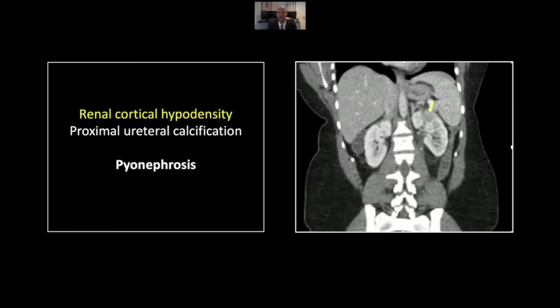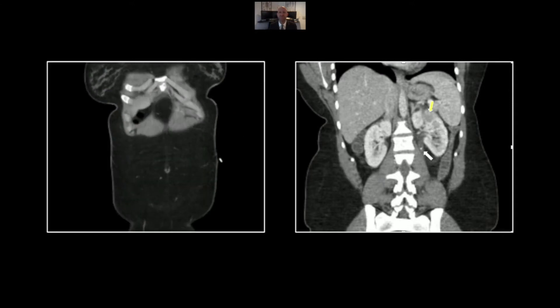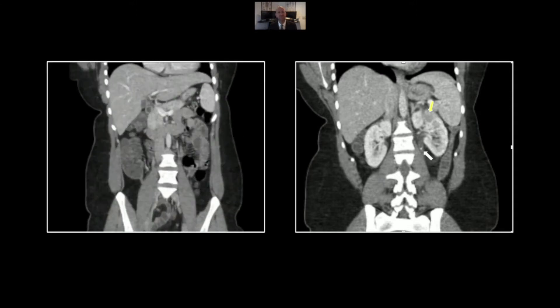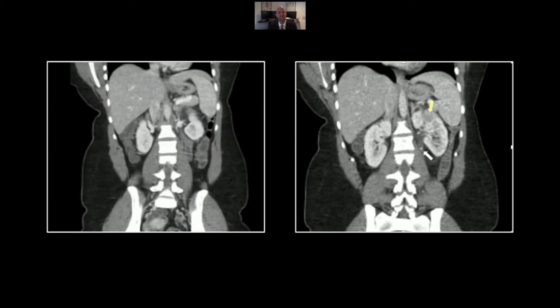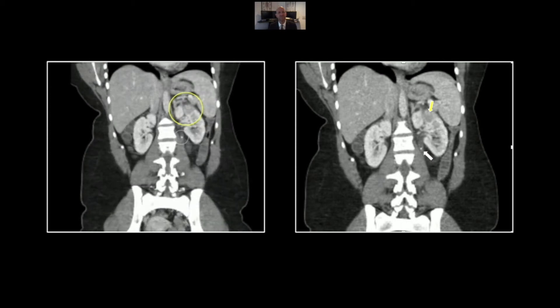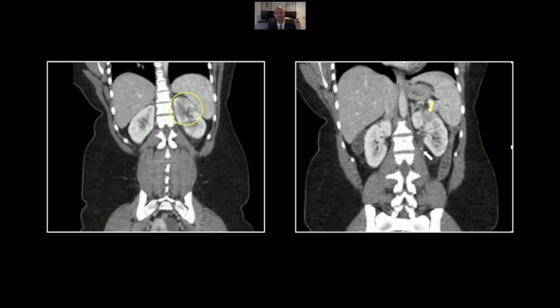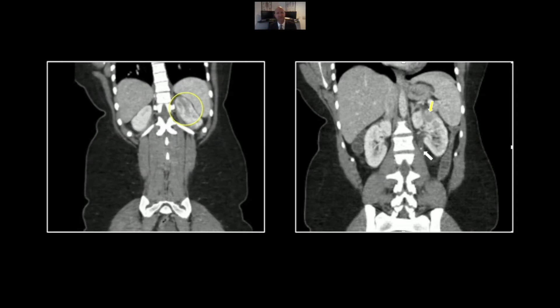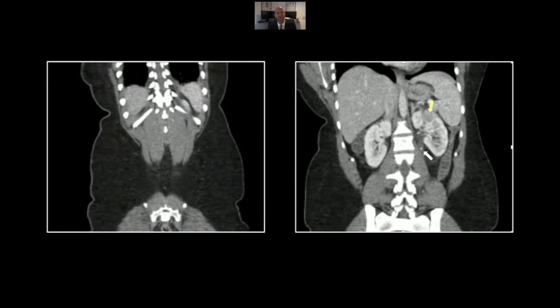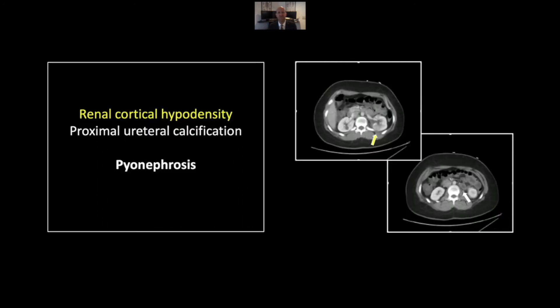Here on the coronals, again, we see that cortical hypodensity and the small obstructing stone. A very nice wedge-shaped striated appearance to the cortex, and another focus posteriorly. That is a case of pyonephrosis.